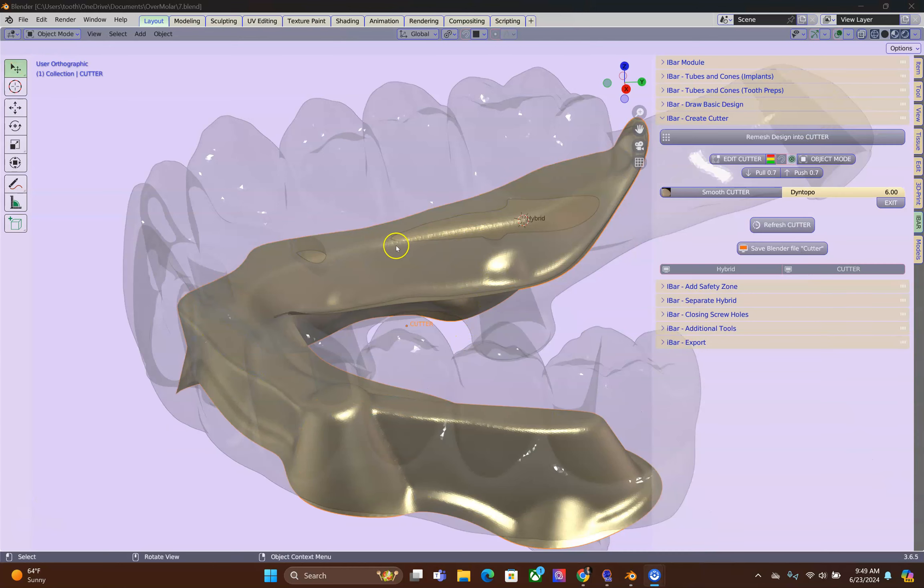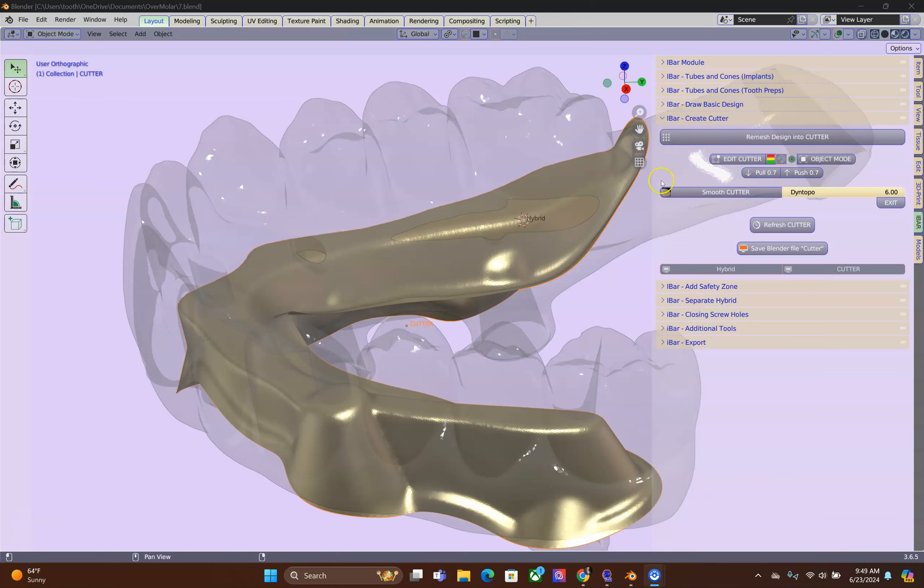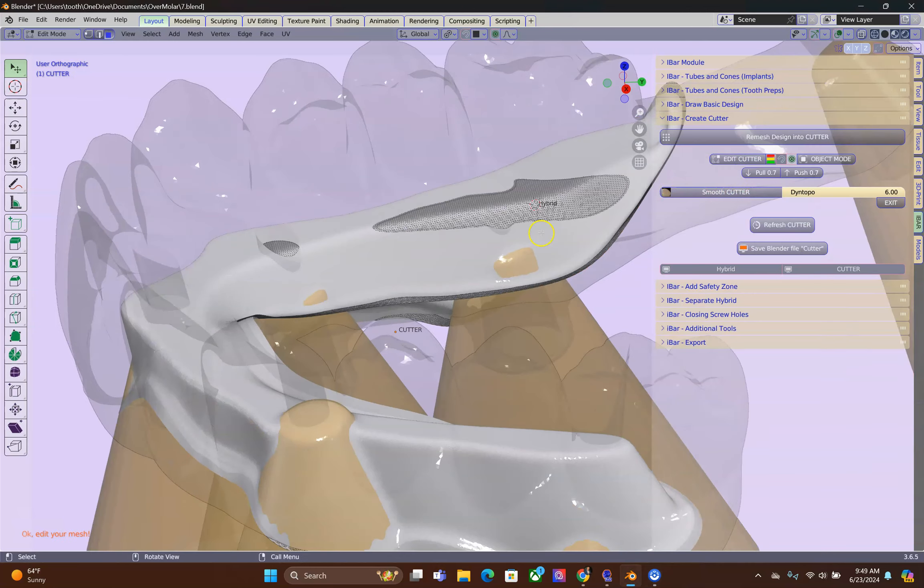I can see a few problem areas. Number one over here and there as well where the cutter is outside of the hybrid. Click on Edit Cutter.